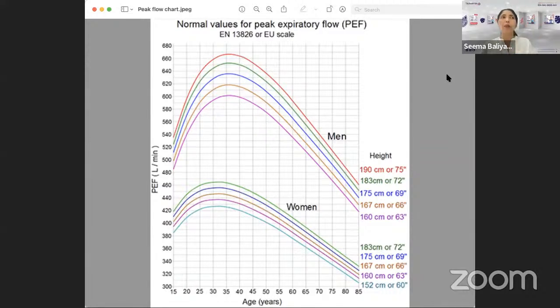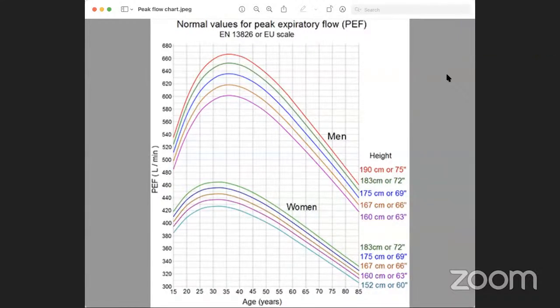Okay, so is that clear to everyone? Any question anyone has on the peak flow? No question? No, ma'am.